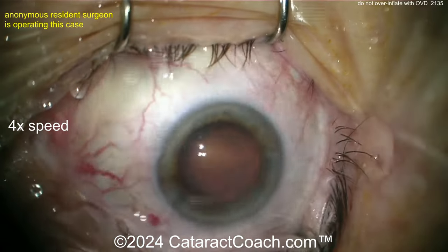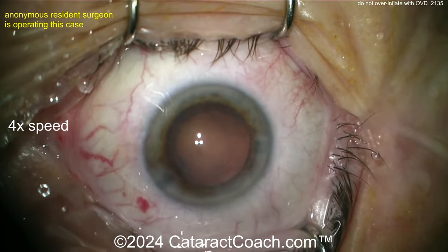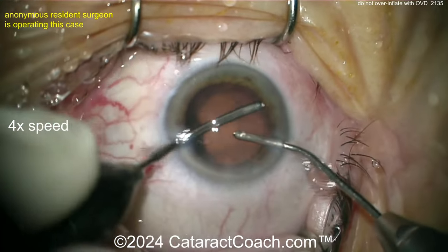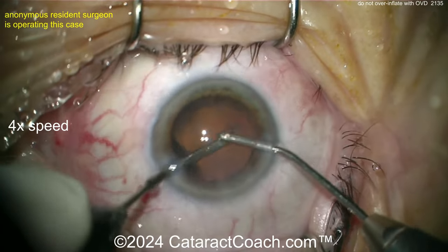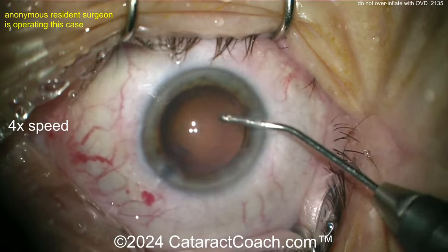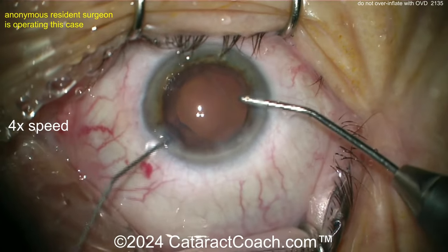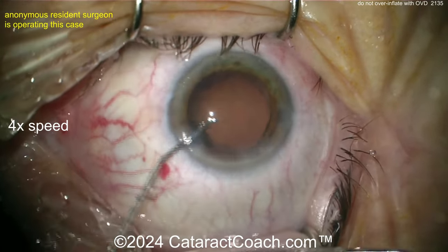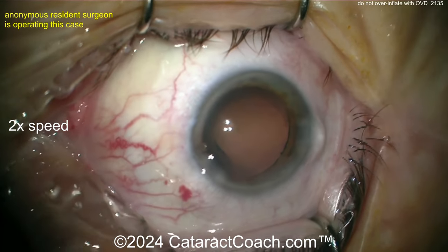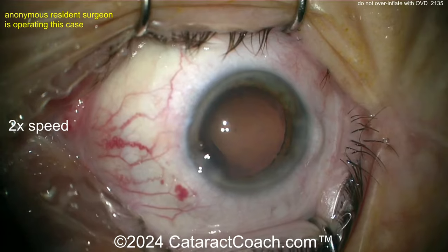Now you should be thinking: what should we do for an IOL? I still think you can get a single-piece lens in the bag — I think it should be fine. I don't think there'll be much of an issue as long as you're gentle inserting the lens. A single-piece acrylic lens is the easiest to insert because it comes rolled up and you've got a nice buffer of maybe 10, 20, 30 seconds to get it positioned before the haptics fully open up.